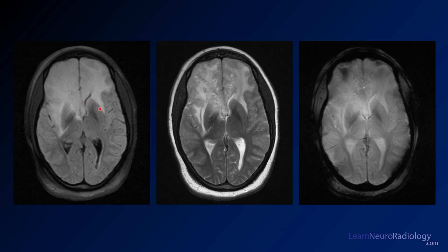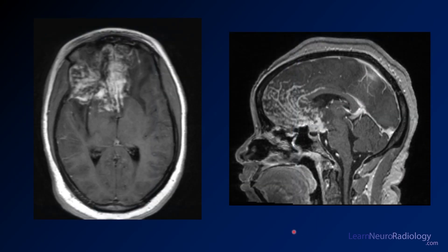On FLAIR, there's abnormality in the frontal lobe with loss of gray-white differentiation on T2, and some areas of intermediate to dark T2 signal. Gradient imaging shows no significant blood products. On post-contrast imaging, there's avid leptomeningeal enhancement following the sulci and coating the gyri, along the surfaces of the corpus callosum, in the basal cisterns, and some nodular solid enhancement in the basal cisterns as well.